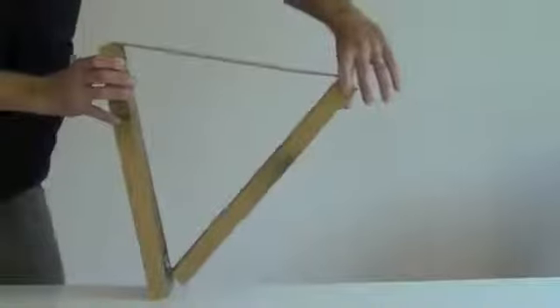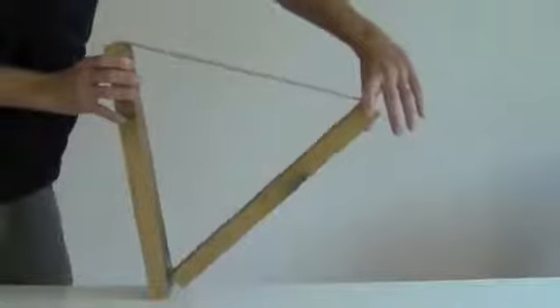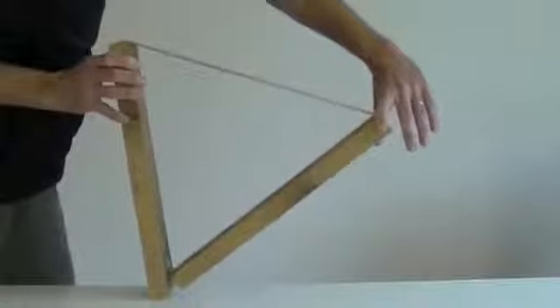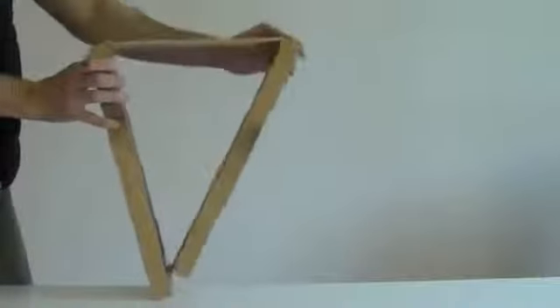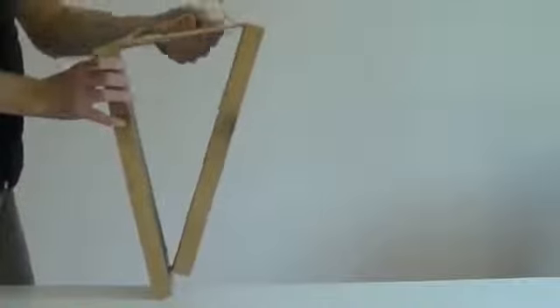You can see here when we stretch that down from the ends, we get quite a strong effect. It moves through a greater distance and it moves much quicker.